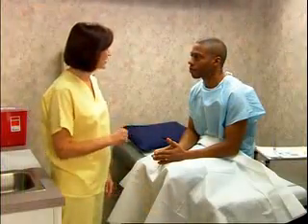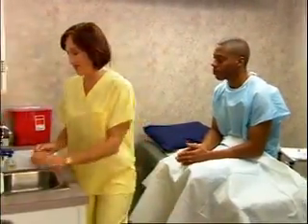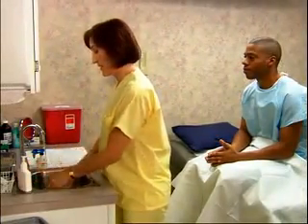Now that we've reviewed some of the general information on giving IM injections, let's review the actual process for giving an IM injection. First, identify your patient and explain the procedure, and then wash your hands.